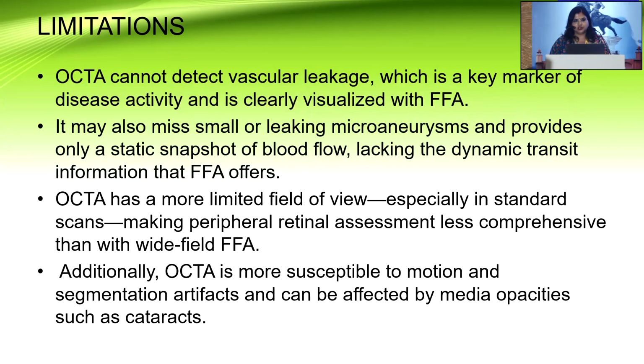What are the limitations which we cannot forget? It cannot detect vascular leakage, which is a key marker of disease activity and is clearly visualized with FFA.